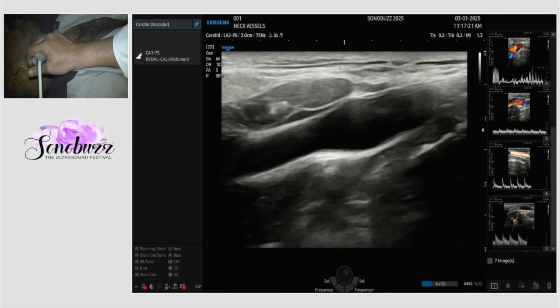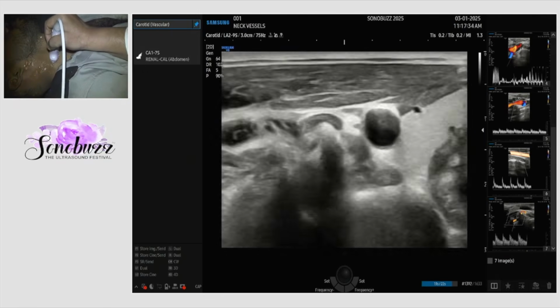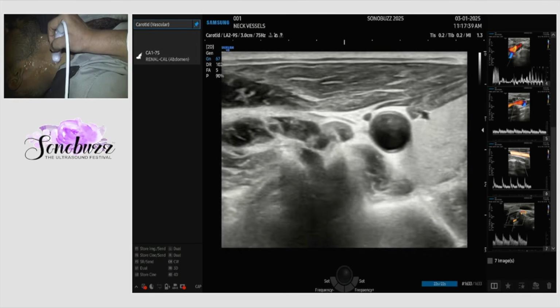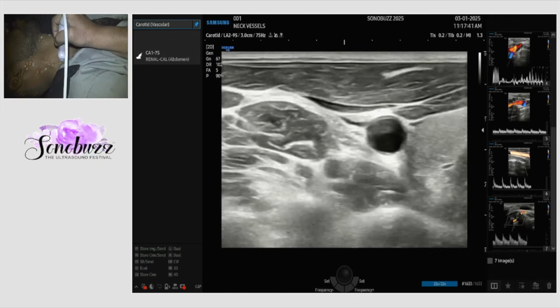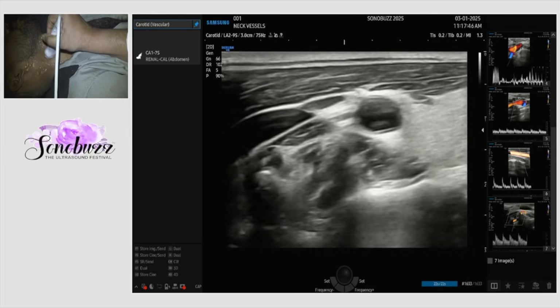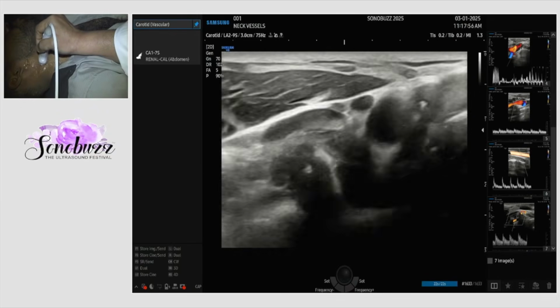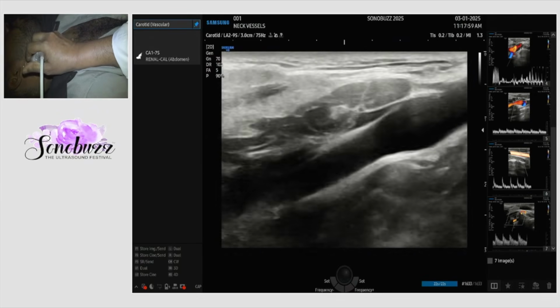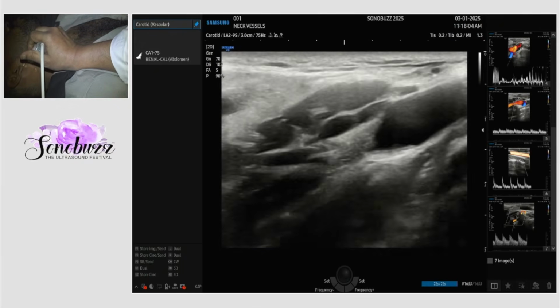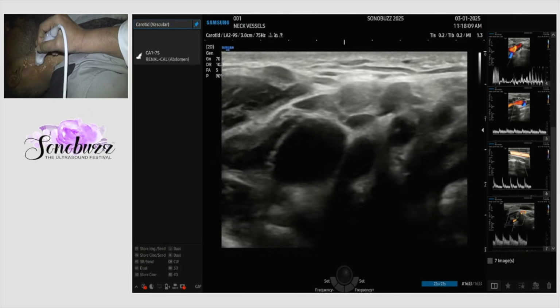Beyond that, now we'll move towards the bulb. Plaque characterization is done simply by B mode, and the B mode characteristic would be either the plaque which is very acute, which will be a black plaque, so you may have to increase your color gain and reduce your tissue harmonics so that you see those plaques better, or they can be gray, which is an intermediate plaque, and then a calcified plaque if it is one. So black, gray and completely white, these are the three types of plaque.